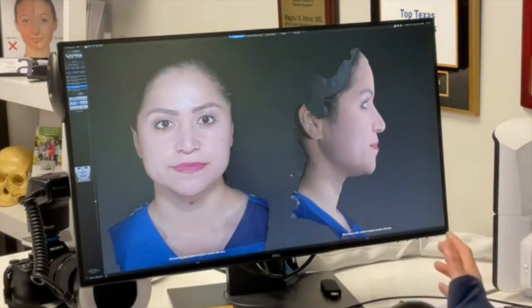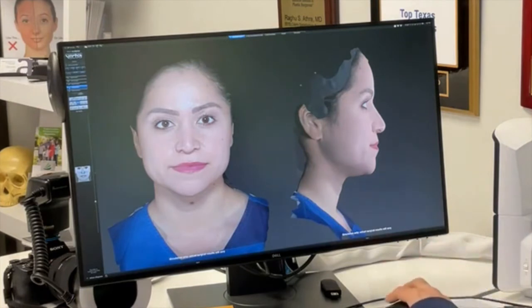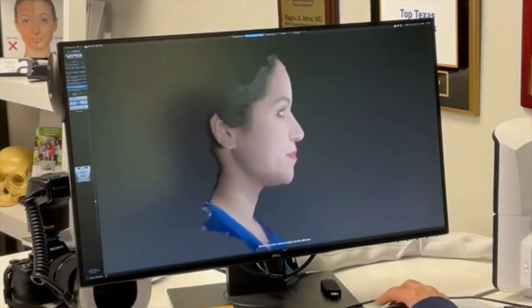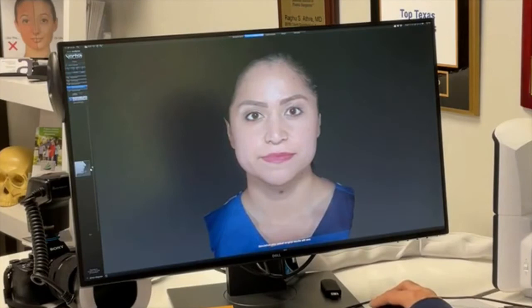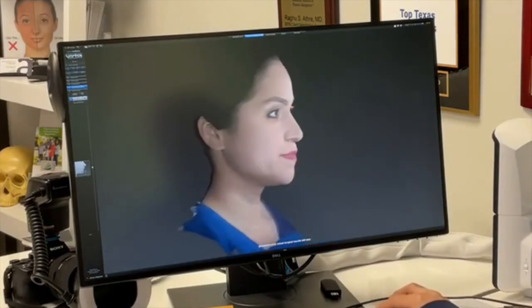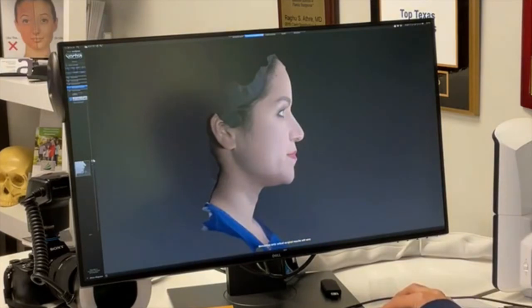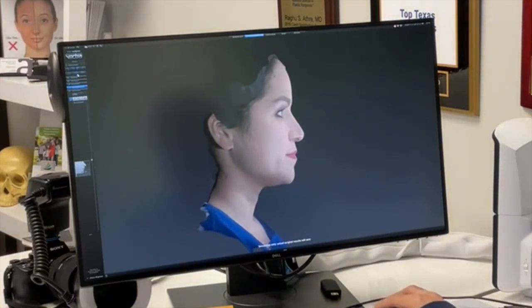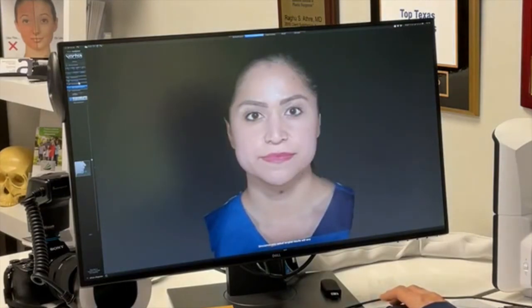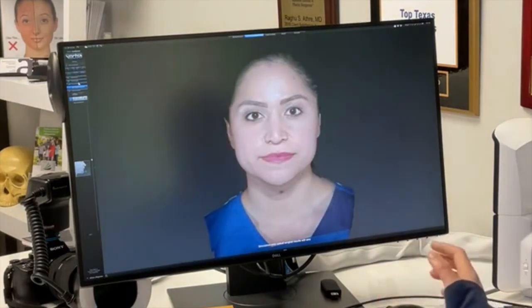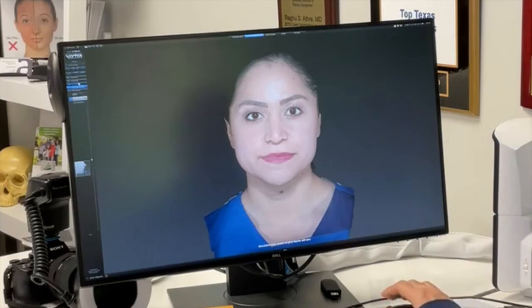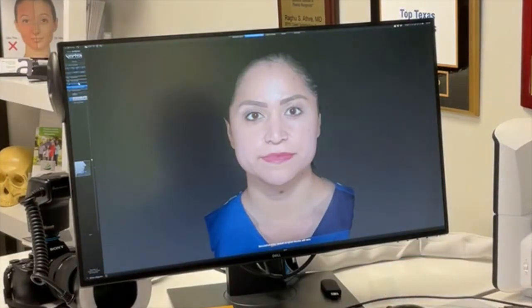As a quick primer on other things we can image — rhinoplasty, but also chin augmentation. If I put in a profile picture, we can give her more of a chin and then look and see what that looks like on the frontal profile with more of a chin. These are all things that can be done with the 3D modeling software.